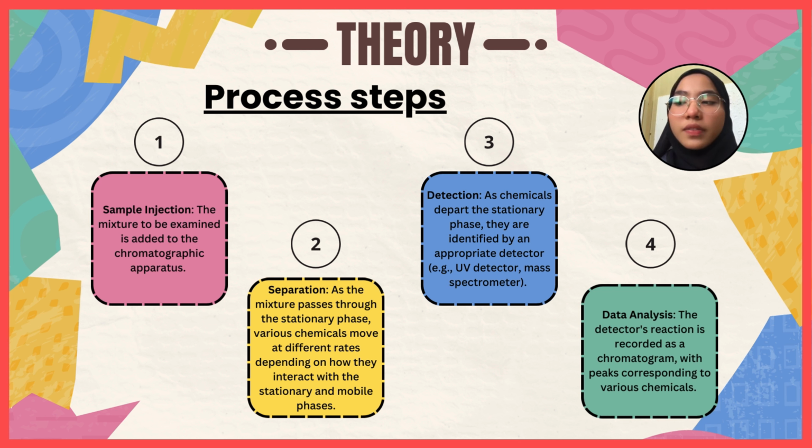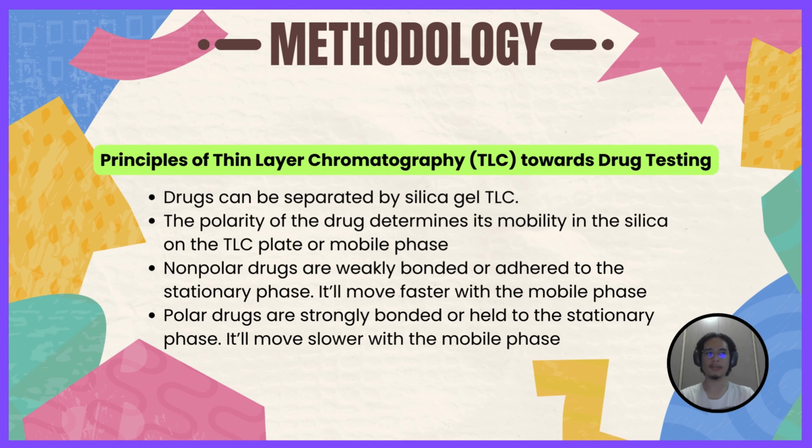Last, we have data analysis. The detector's reaction is recorded as a chromatogram with peaks corresponding to various chemicals. In this part of the video presentation, I would like to share with you all one or two principles of thin layer chromatography, or TLC for short, towards drug testing.